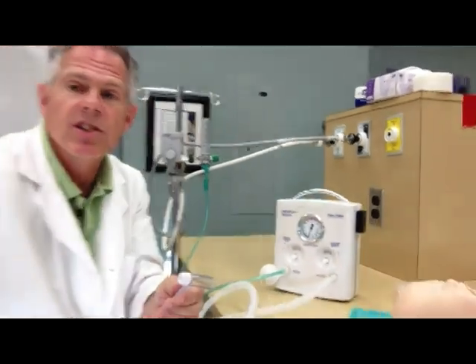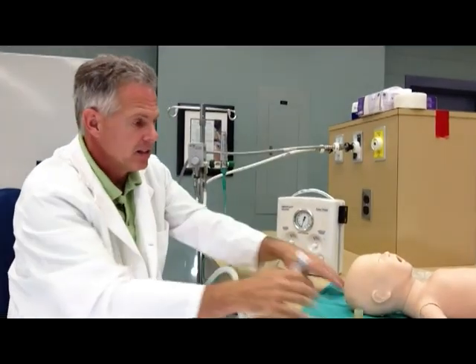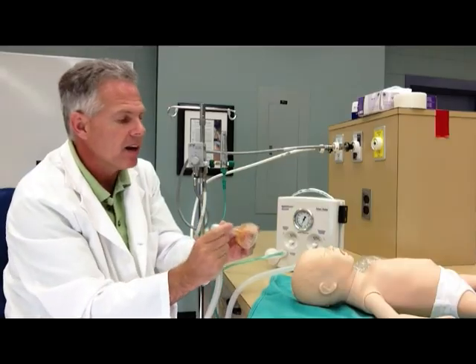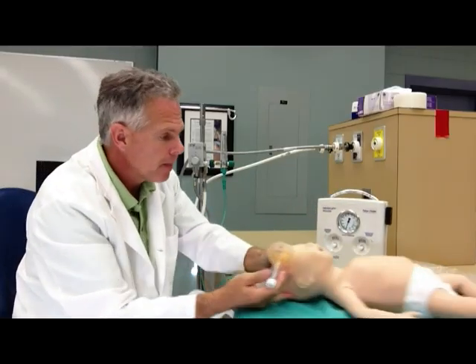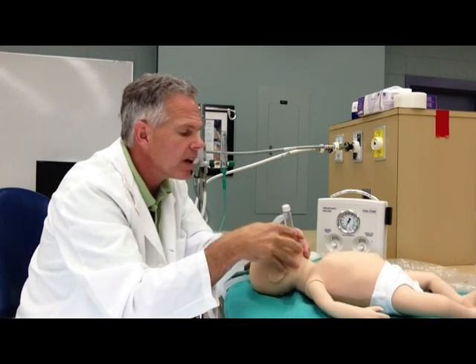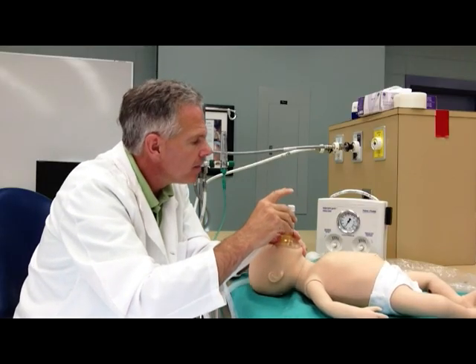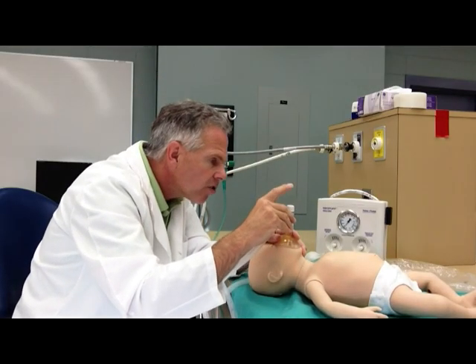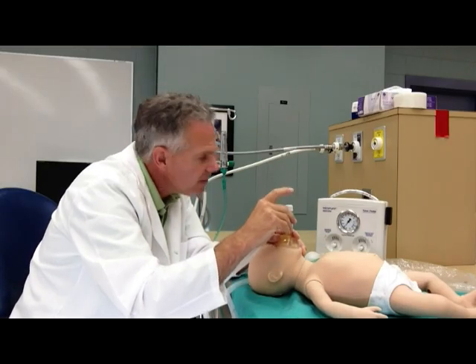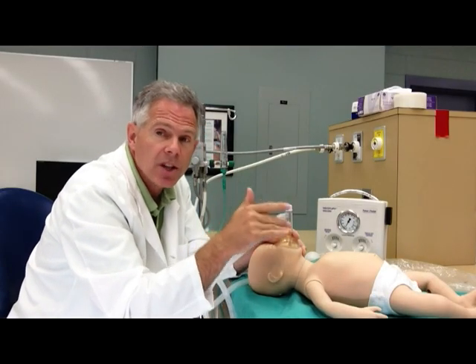So let's see how that's going to work with resuscitation of my neonatal patient. I've got the Neopuff all set up and I've got a mask that I've selected. We're just going to fit that gently over my patient, get a good seal, and get them in a nice sniffing position using my fingers to hold that. Then I can just ventilate my patient on 20 over 4. You can see the chest rising gently and the ventilator cycling at 20 on 4 in the background.